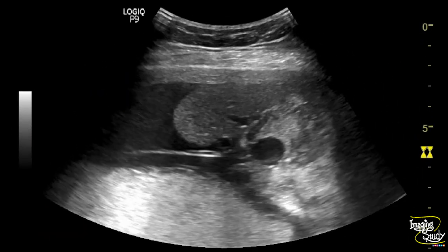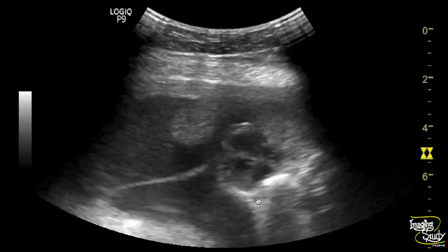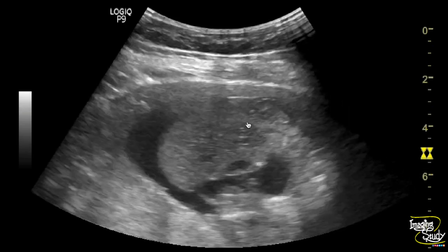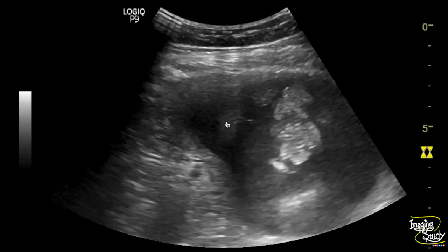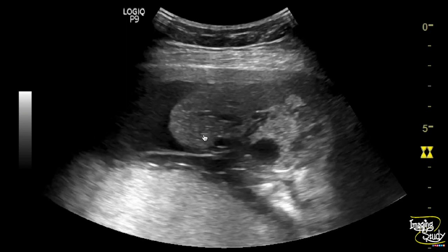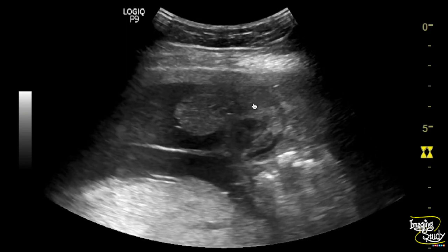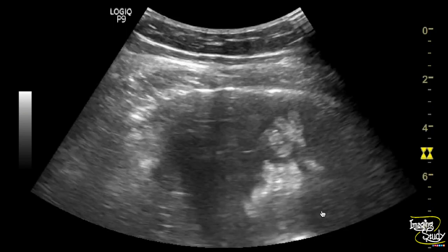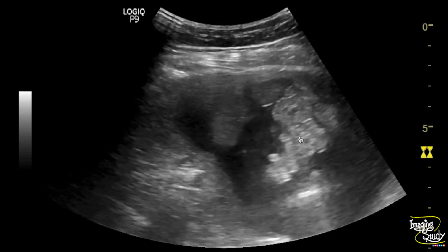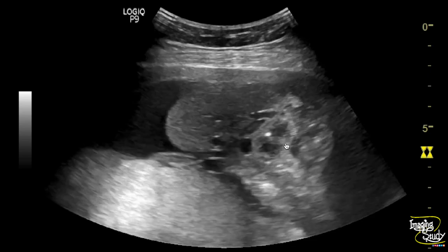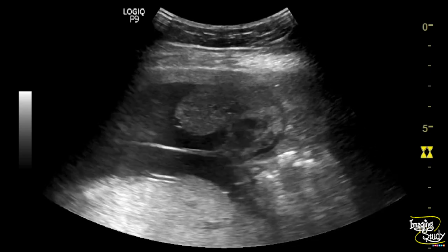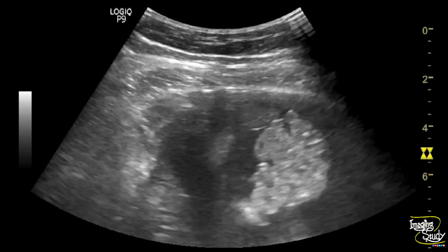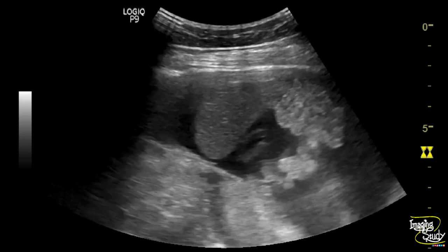Here you can see the cross-section of the fetal thoraco-abdominal region. You can see a large mass-like area floating within the amniotic fluid. This structure is the liver, and these are the small intestinal loops — they're floating within the amniotic fluid. So there is some abnormality going on.